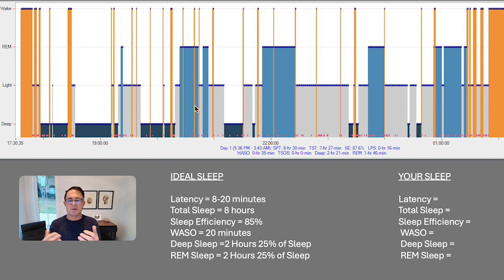And that's why some people say, well, I only need a few hours of sleep. That is correct for the body, but it's not correct for the brain, because the brain needs the next 4 hours to do all the REM pieces that we see here, which is the kind of aqua or light blue color here. We need to have a lot of that REM late in our sleep cycle.